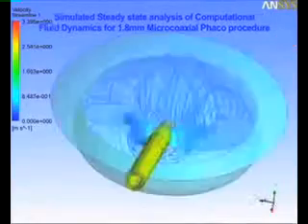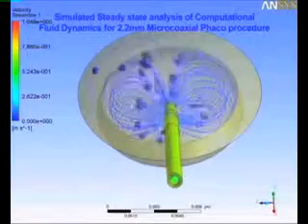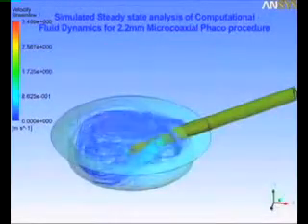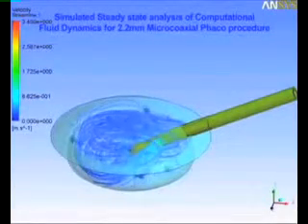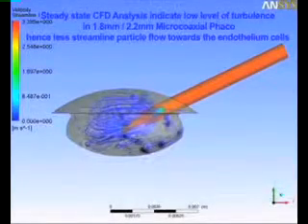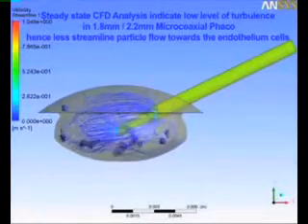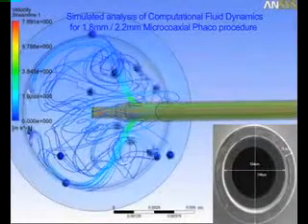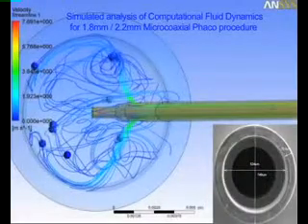Analysis using computational fluid dynamics software, applying the Reynolds stress equation for a turbulent 3D modeled mesh of the human eye anterior chamber as an enclosed fluid domain. In the case of a 1.8 mm incision, while simulating a streamlined flow pattern for 25 randomly irrigated fluid particles, it is observed that at a given time only 2 fluid particles were aspirated because of the phaco tip's smaller inner lumen, and the other remaining particles stayed back, confirming a deeply maintained anterior chamber.